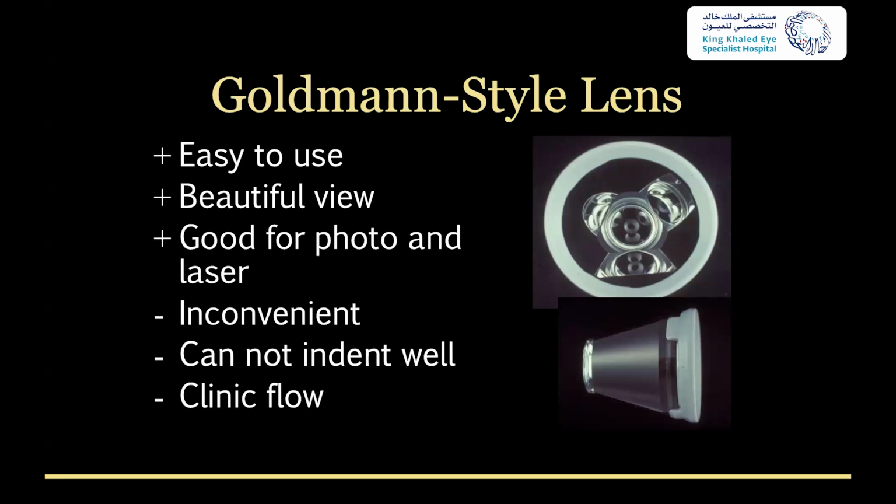So, if you see a patient, do vision, pressure, slit lamp, gonioscopy, then you send them off for fields and photos and OCTs, etc. If you've done Goldmann style gonioscopy and you put methylcellulose on the cornea, you'll get lousy exams for the rest of the visit. So it's not something that I can use in a normal clinic.